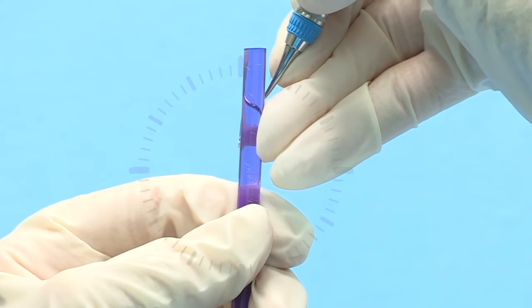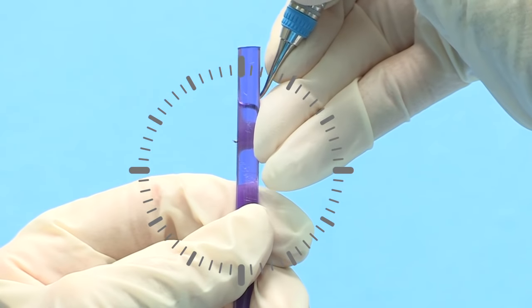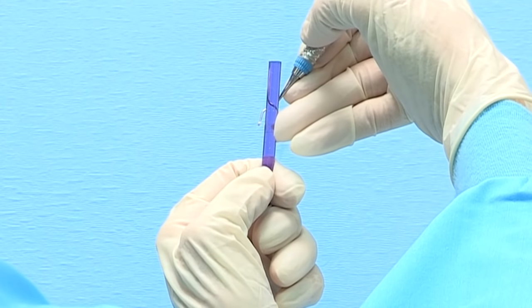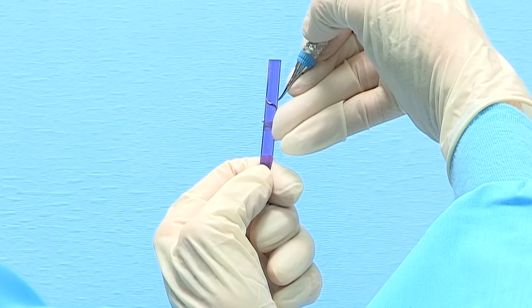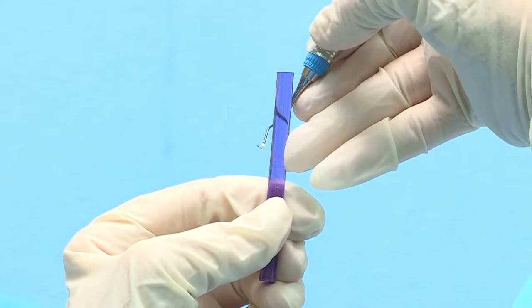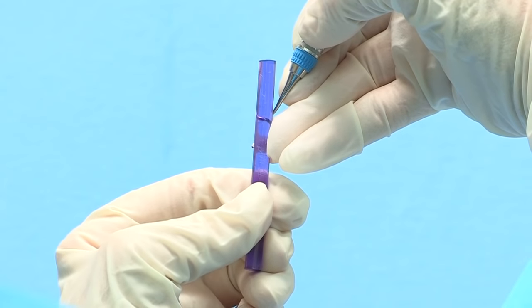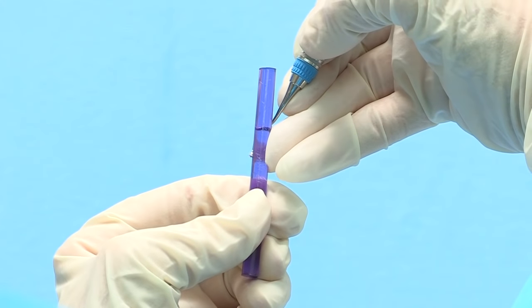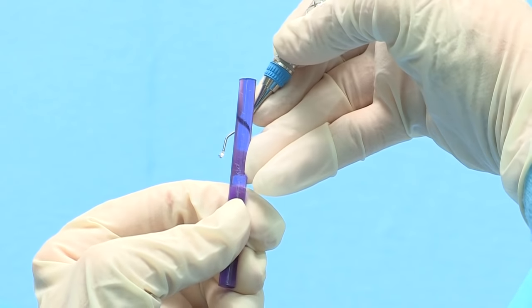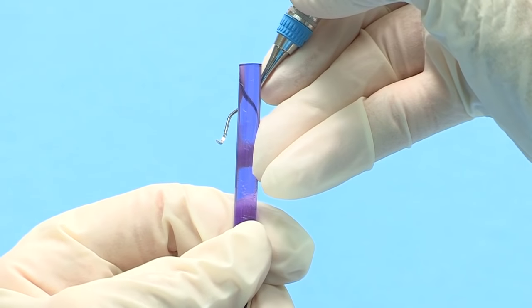Testing Gracie curettes for sharpness is extremely easy because the downward slope of the blade automatically positions the cutting edge at the correct position on the test stick. The position for the terminal shank of the Gracie curette and the test stick will both be at 12 o'clock. In your dominant hand, hold the instrument with a modified pen grasp. For odd-numbered working ends, the toe will be pointed toward you. Bring the instrument behind the test stick and place the cutting edge against the left side of the stick. Place your ring finger against the opposite side of the test stick to act as a fulcrum. Press the cutting edge into the test stick and release — if the instrument is sharp, it will bite or grab the test stick and you will hear a metallic sound or ping. Be sure to test the entire length of the blade.